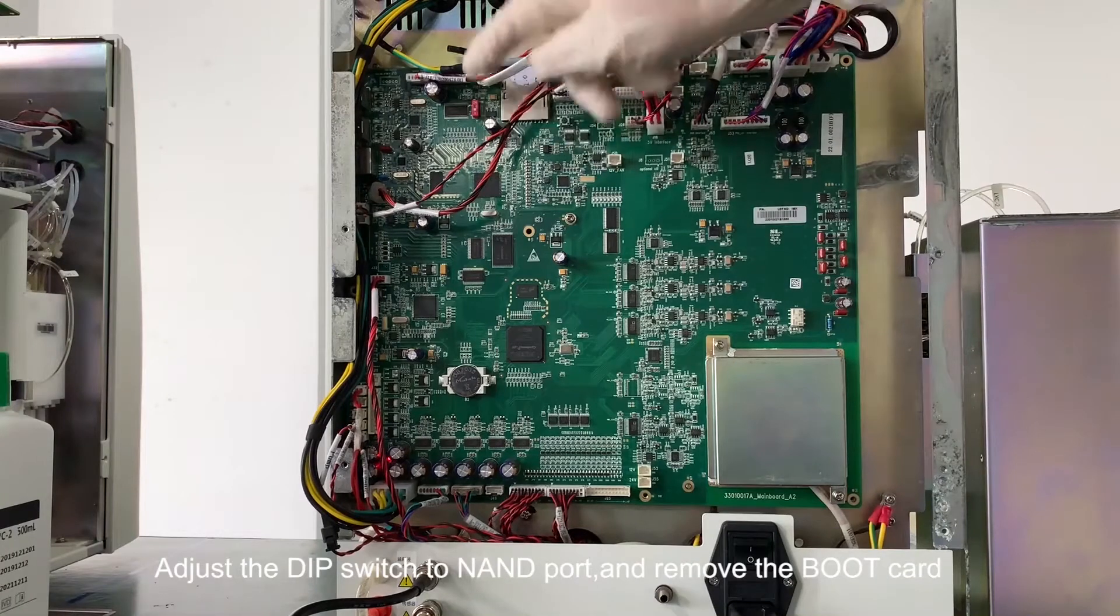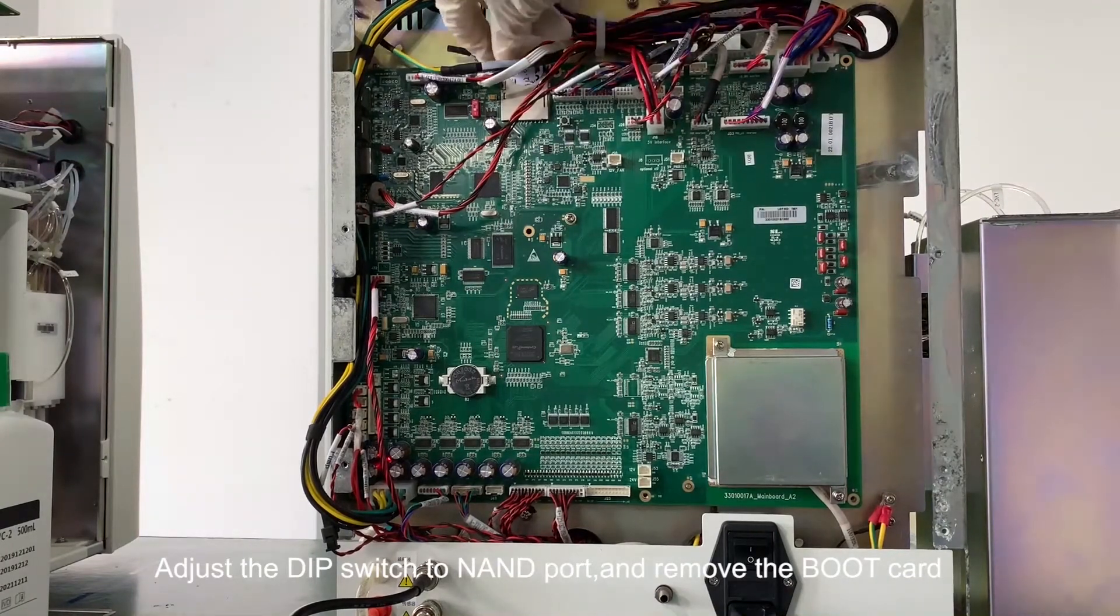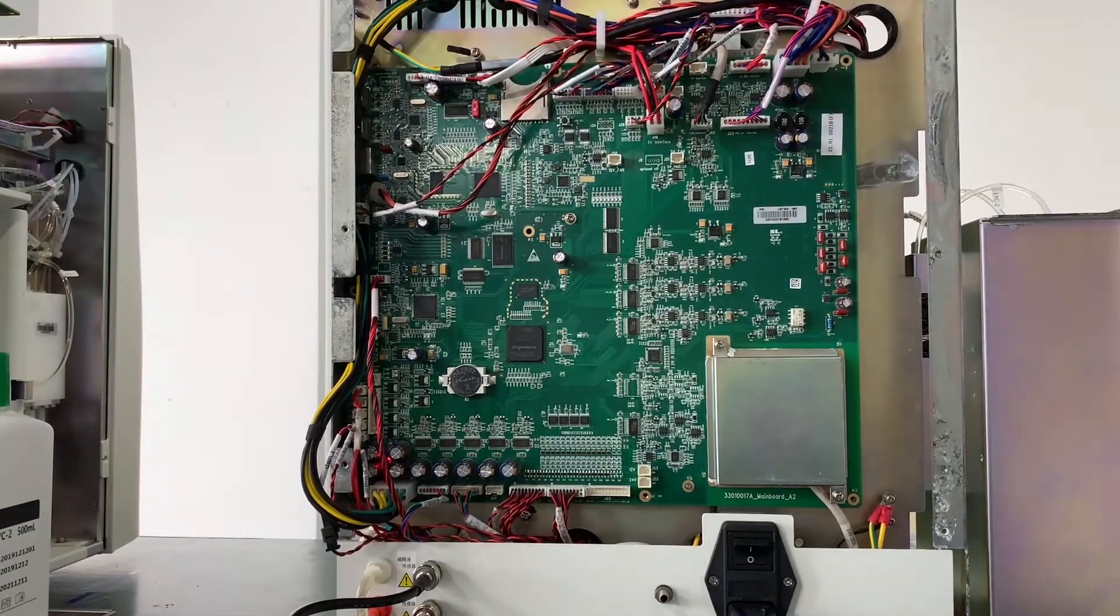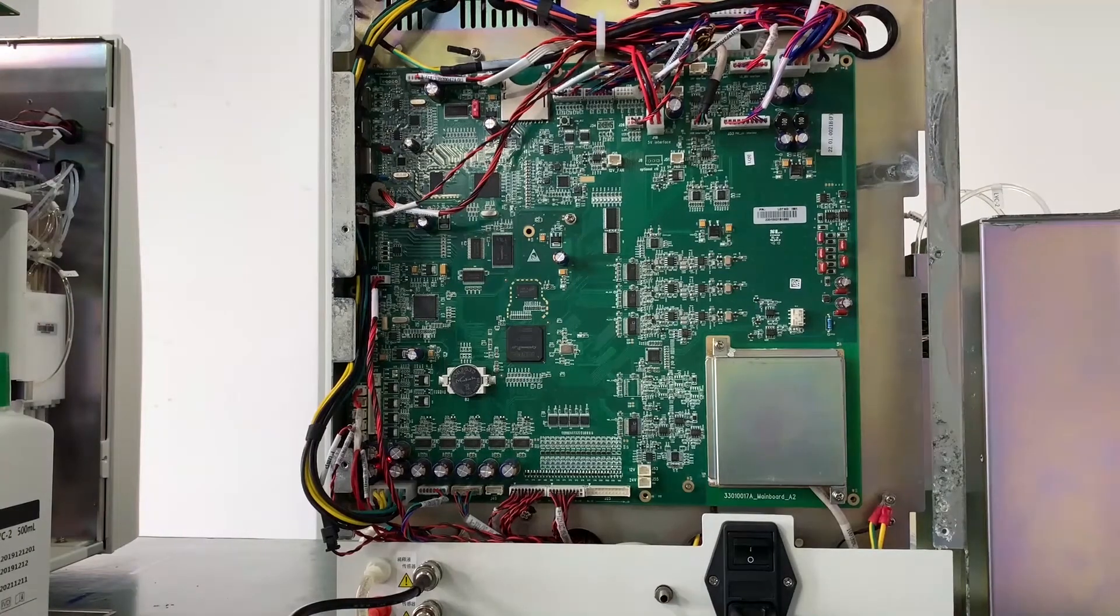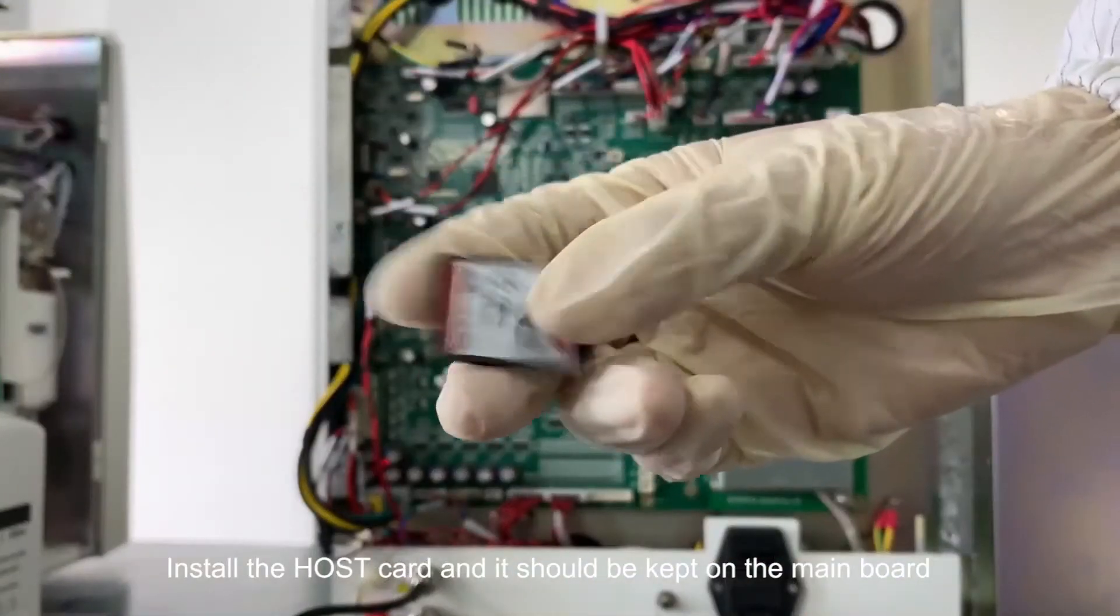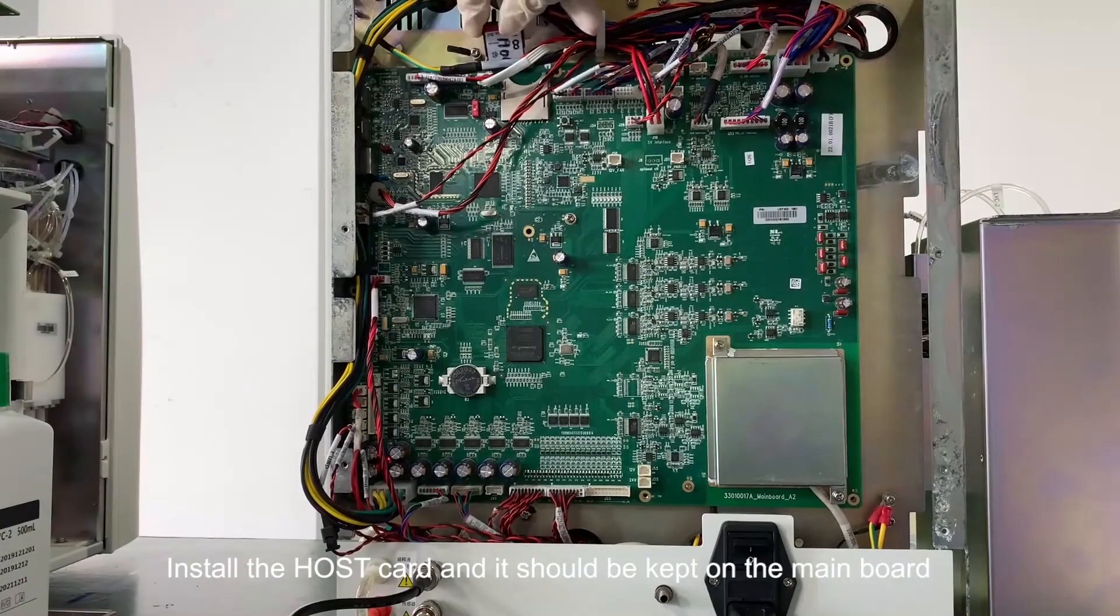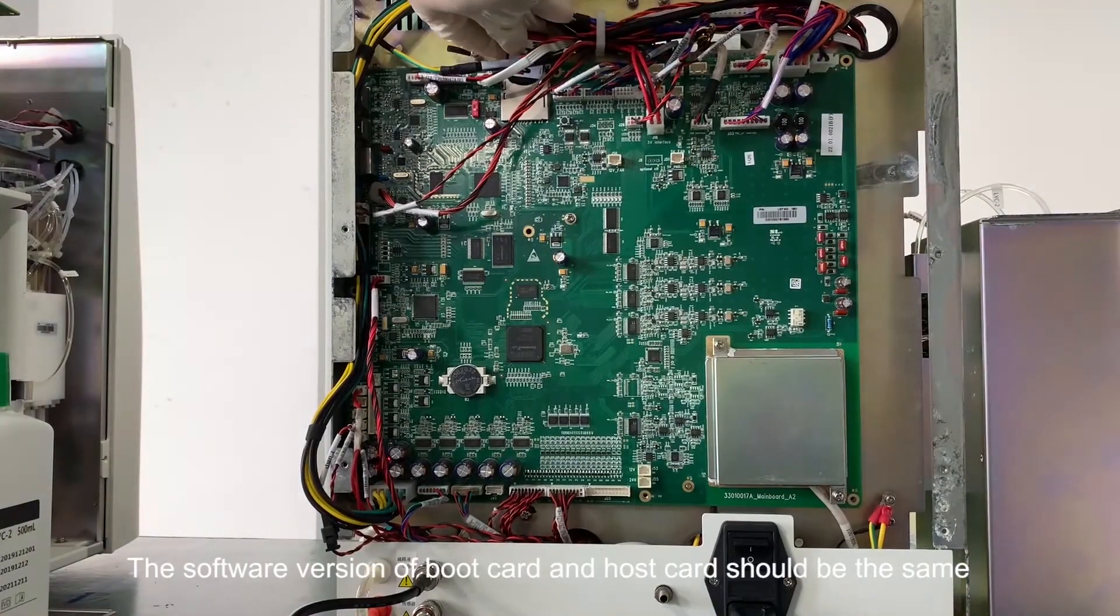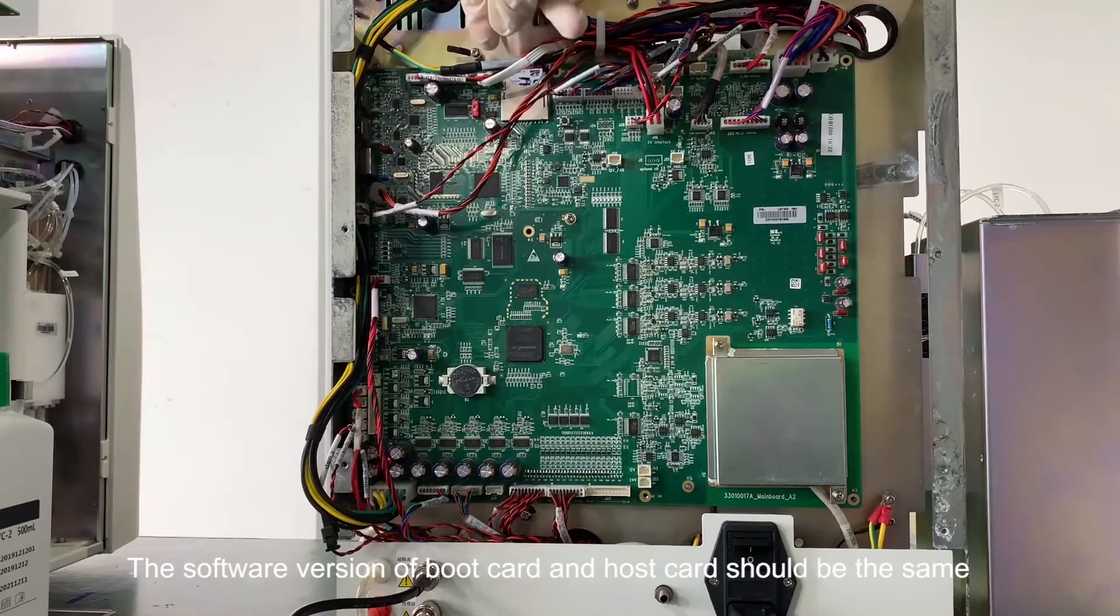Adjust the DIP switch to NAND port and remove the boot card. Install the host card and it should be kept on the main board. The software version of boot card and host card should be the same.